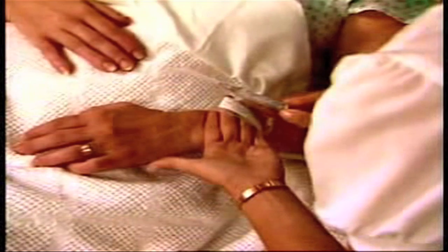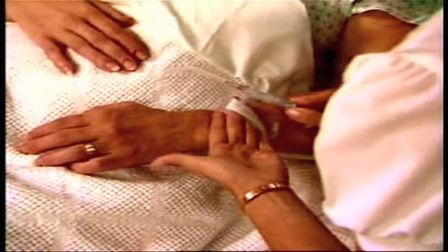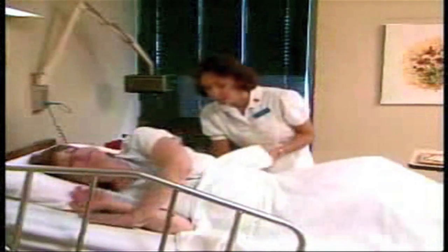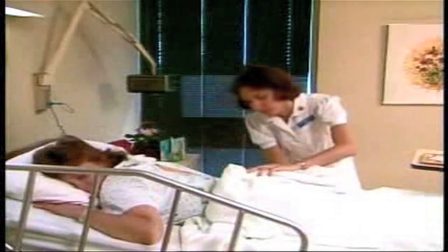Reconfirm that the dosage, route, and time also are correct. Then help the patient into the appropriate position and expose the injection site. Protect the patient's privacy throughout the procedure.